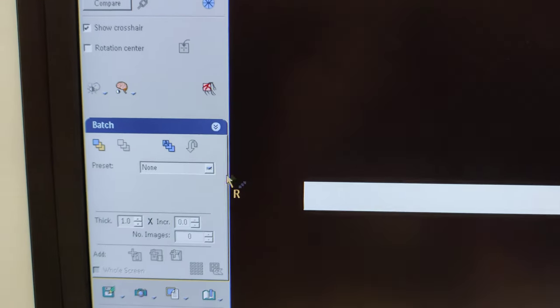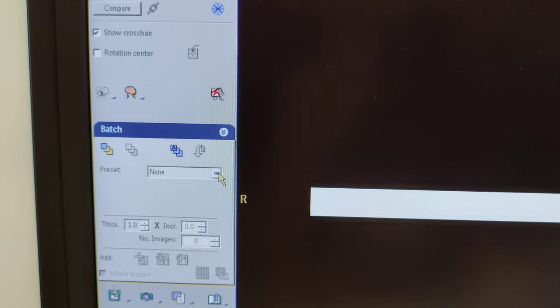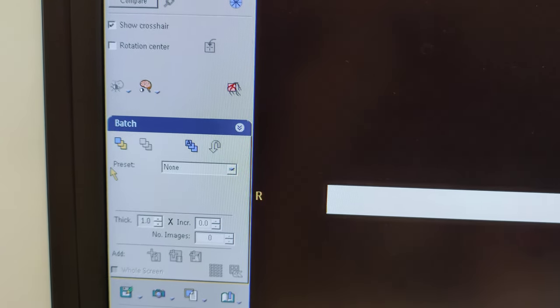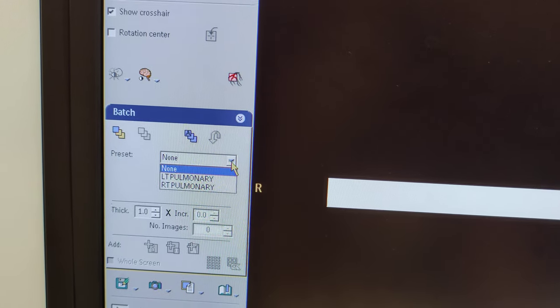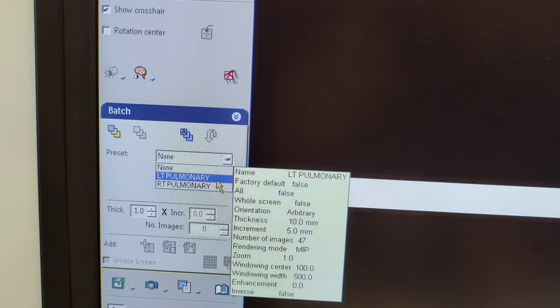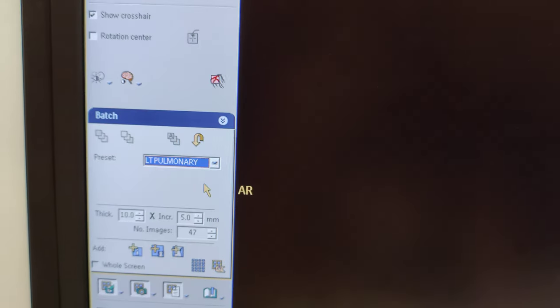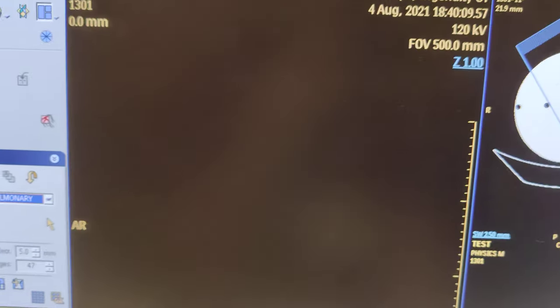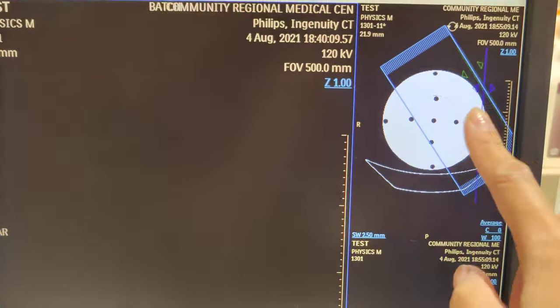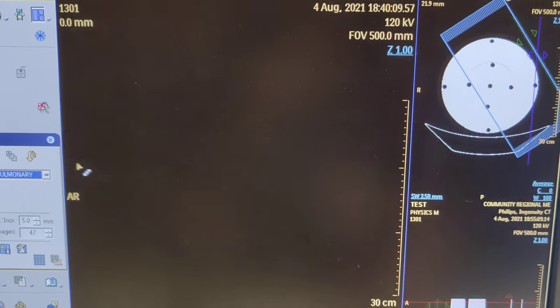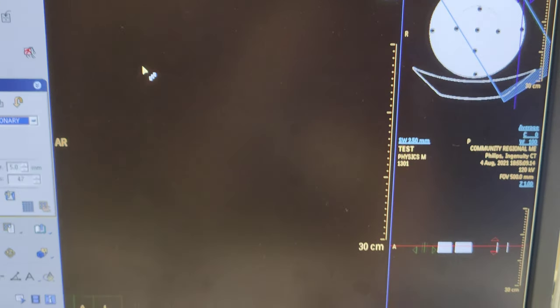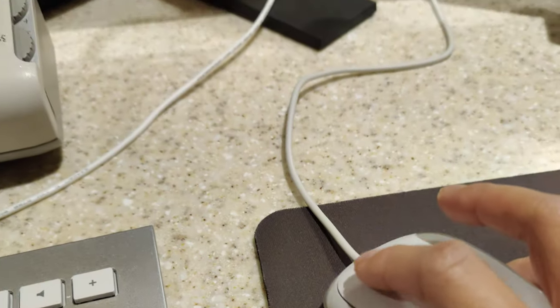Once you're there, you're going to click your preset to your left pulmonary. Then once you click that, this is going to pop up and you're going to left-click right here.